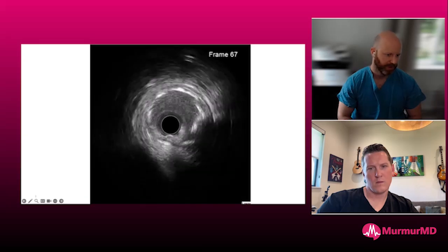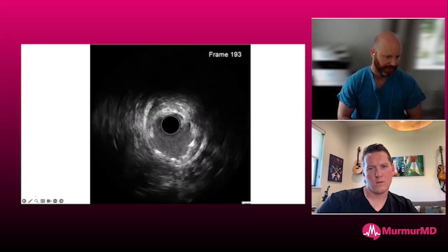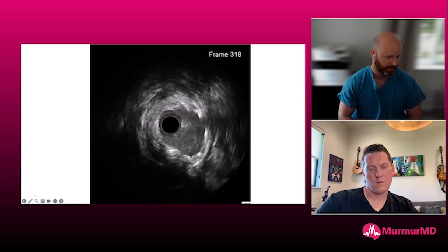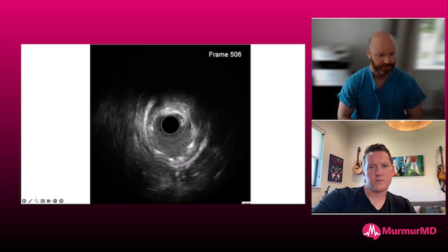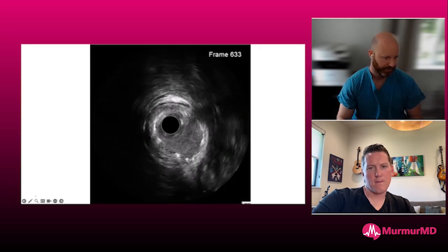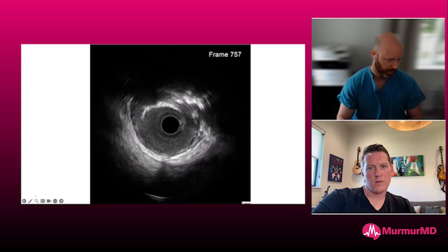And then we found what we felt like was a decent, healthy landing zone. A lot of modified plaque. We're going to post dilate this stent more aggressively after we're done, but this is just sort of an IVUS after stent implantation. That looks great. And we like it. I mean, we're circular. There's a lot of plaque outside of the stent. And so I think people have to be really careful though, when they measure these things. You can't just go measure the media to media again, and then go ahead and post dilate this.